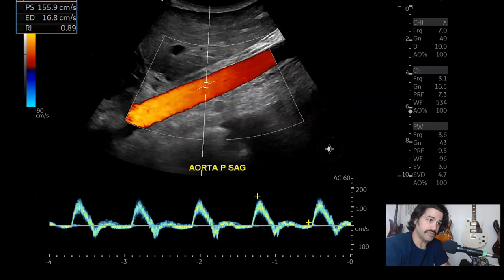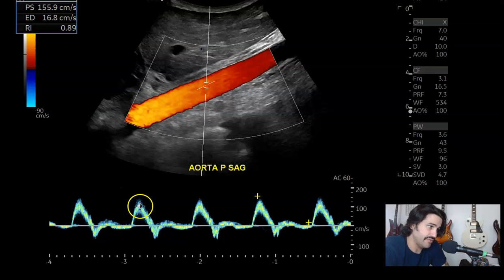So then spectral Doppler, or PW — here you got a nice beautiful triphasic waveform, very clear spectral window. I like to make sure that my sweep speed is at five, because normally the sweep speed is at three. I like it at five to give some nice space in between the peaks.